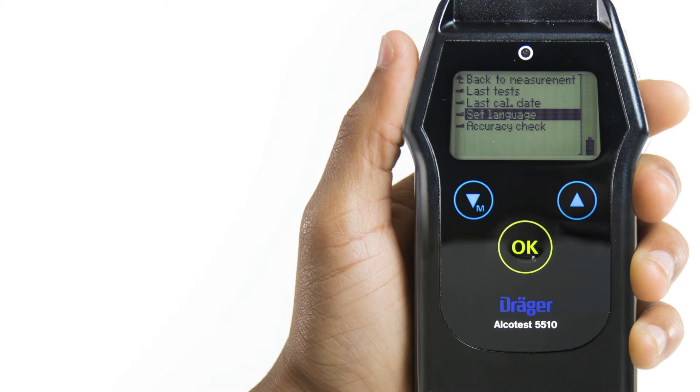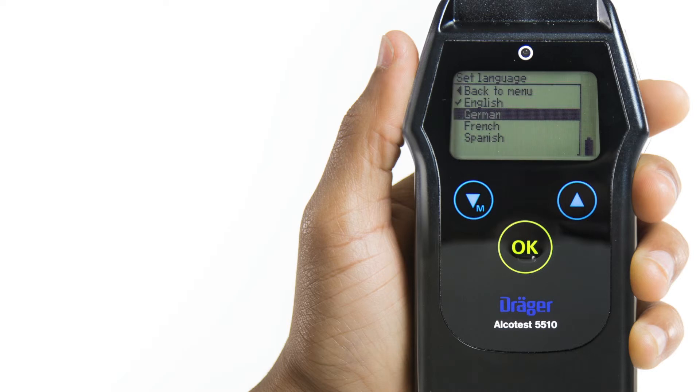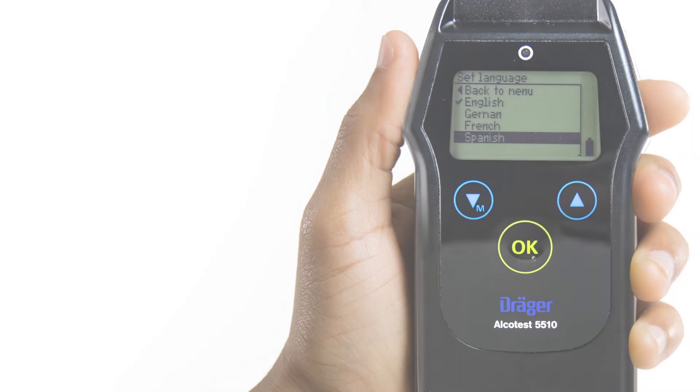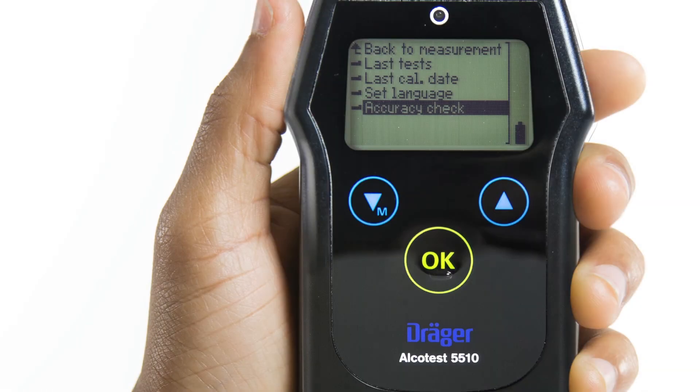The Set Language menu lets you select the display language in English, German, French, or Spanish.